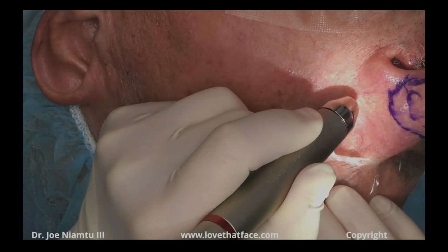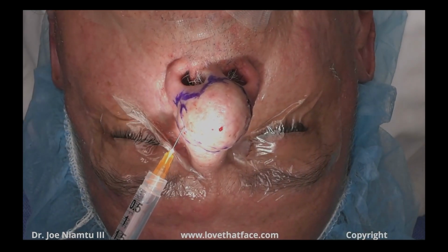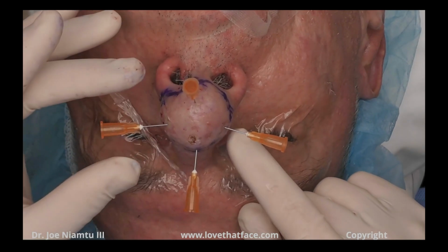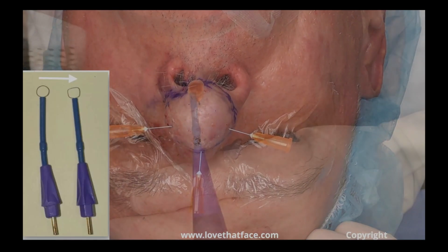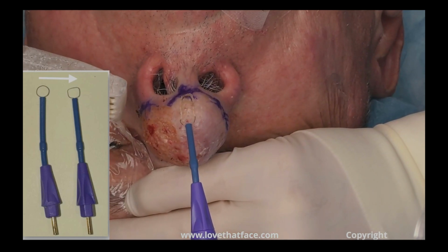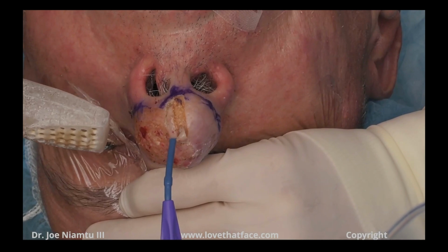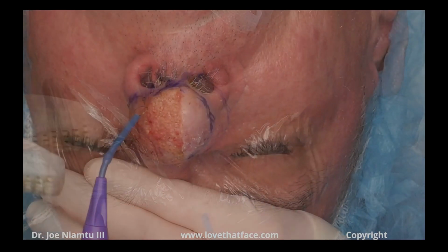starting with a 532 laser to remove any spider veins which will bleed during the procedure, then infiltrating with 2% xylocaine, 100,000 epinephrine. I'm sounding the depth of the Rhinophyma down to cartilage or bone so I can estimate a depth. I have formulated a loop electrode into more of a flat surface like a cheese wire.